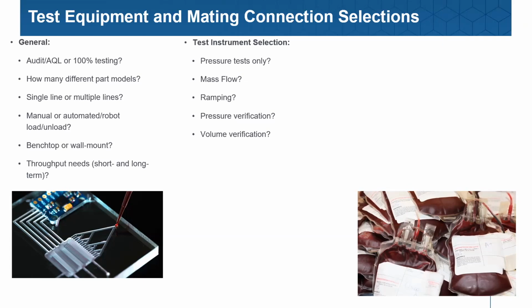Well said. I mean, that's exactly right. And the best part about that type of volume test that Russ just explained is that this works two ways. It can be used to verify that we are actually subjecting the entire interior of the part that we're designed to test. We're exposing the entire interior.